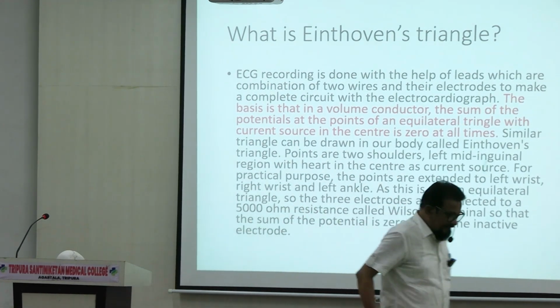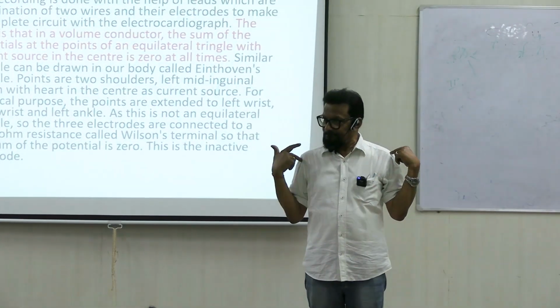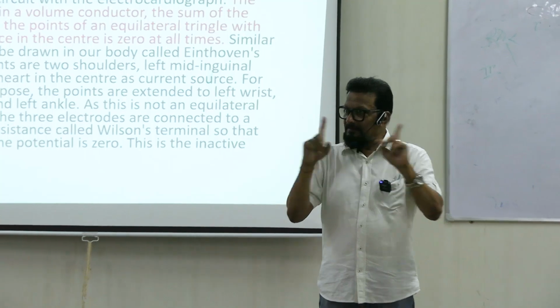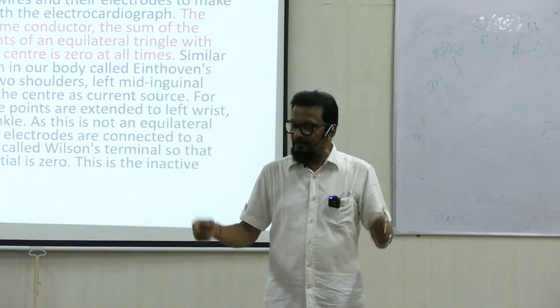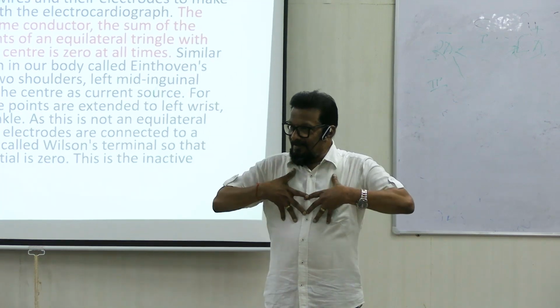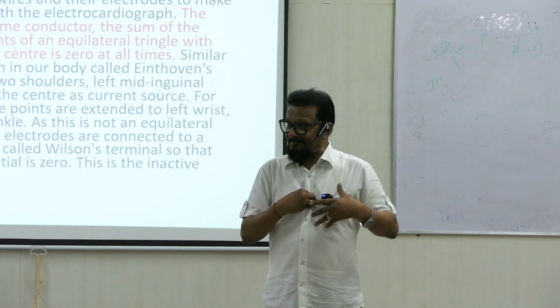Assume an equilateral triangle on the chest, keeping the heart at the center.